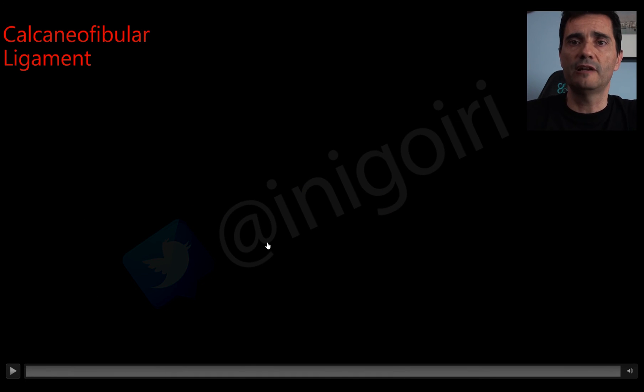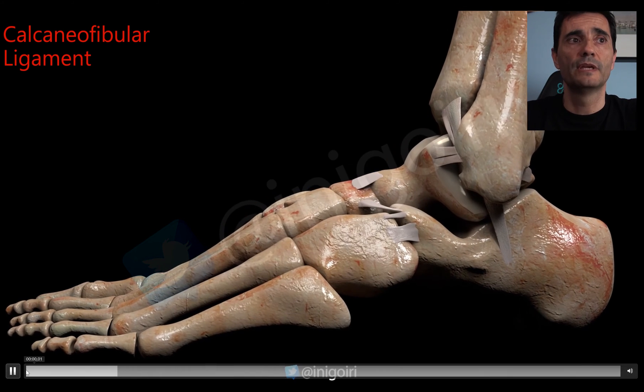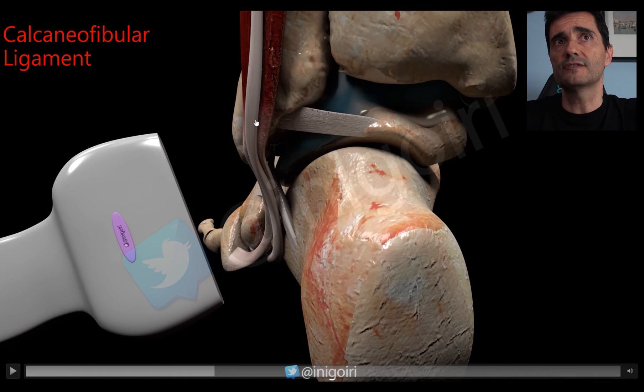Finally, the calcaneofibular ligament. Anatomically, it is a narrow and long ligament, originating at the tip of the fibula with a slightly posterior direction, inserting in the calcaneus. It has a close relationship with the peroneal tendons, which pass below the lateral malleolus and, when they turn lateral, pass just above the calcaneofibular ligament. Following the peroneal tendons and noting the cortical of the calcaneus, between the cortical and the tendons we will notice this ligament.